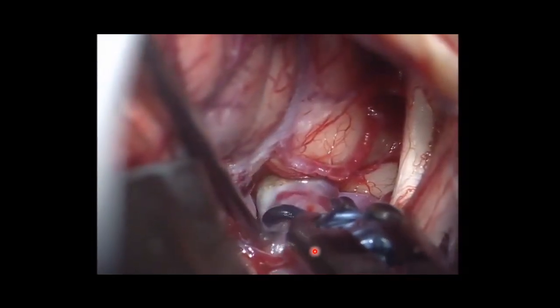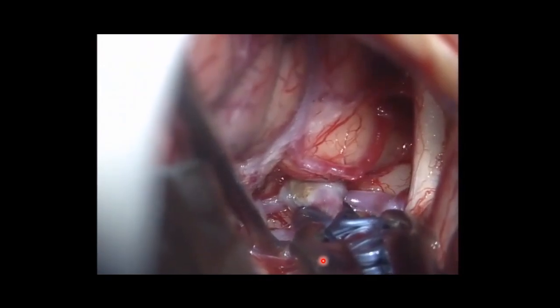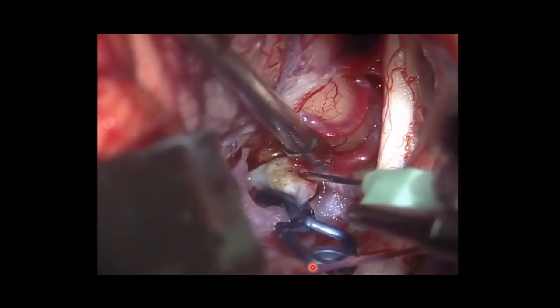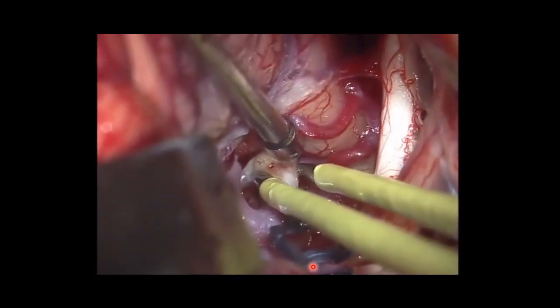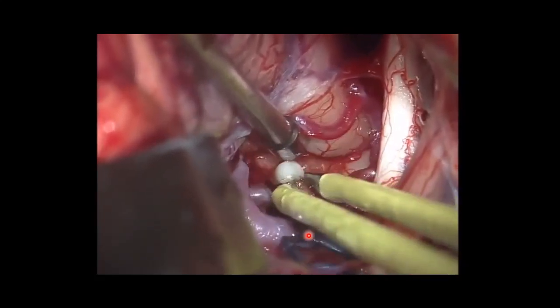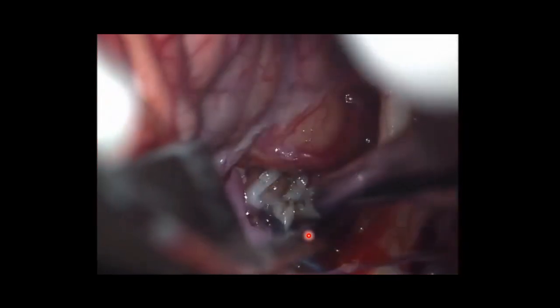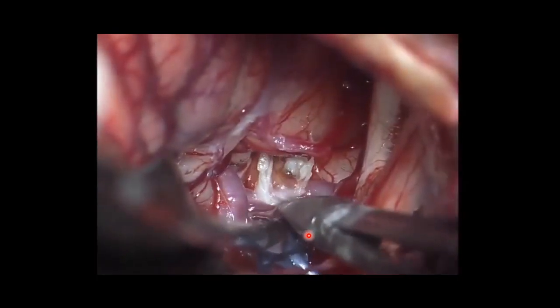Now it's a semi-curved clip. It's a less curved clip than the previous one. And now I think the aneurysm has been completely clipped. Now puncturing the aneurysm, so it's not bleeding anymore. Coagulating once again the aneurysm. And cutting the aneurysm. The aneurysm has been completely opened.